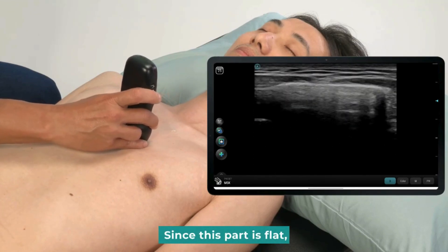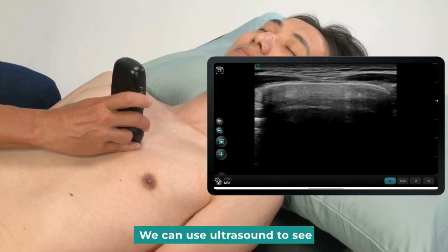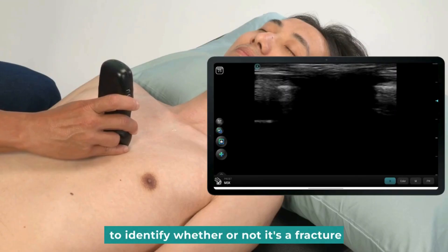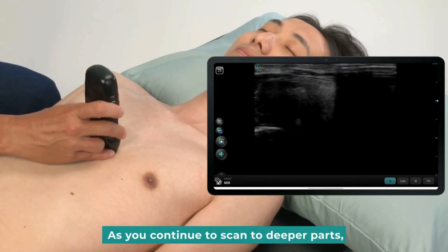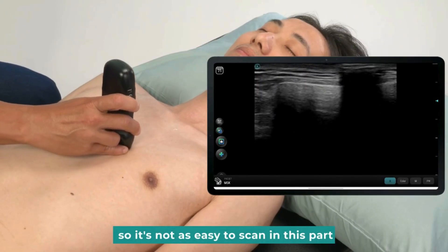Continue to scan since this part is flat. So if there is a fracture, we can use ultrasound to see. If there is a high and low difference, to identify whether or not it's a fracture. As you continue to scan to deeper parts, because it is soft tissue, it's not as easy to scan in this part.